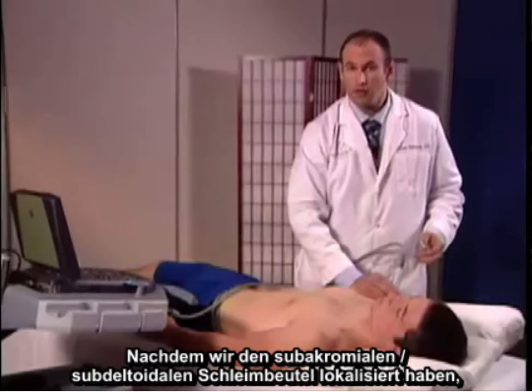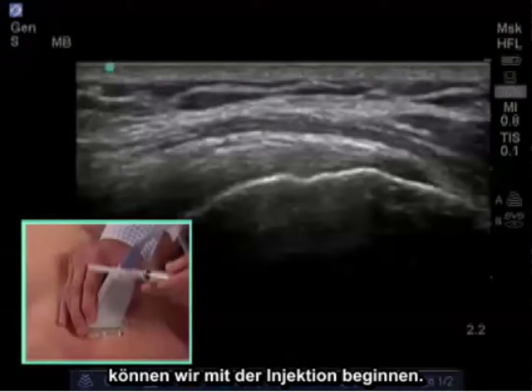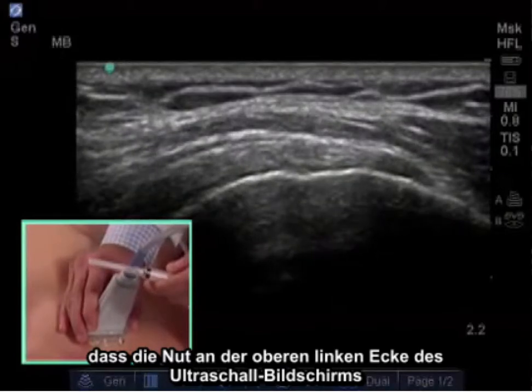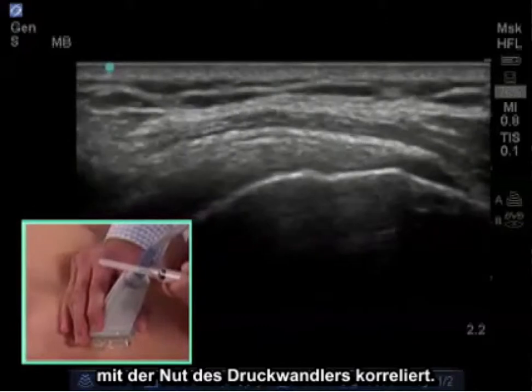Now that we've localized the subacromial subdeltoid bursa, we're ready for injection. Again, remembering our landmarks that the notch of the upper left-hand corner of the ultrasound screen correlates with the notch on the transducer.